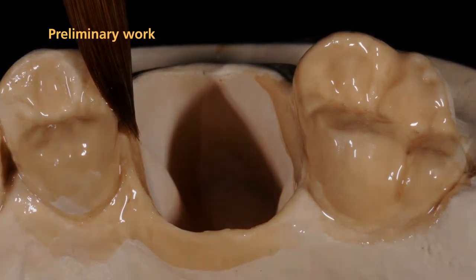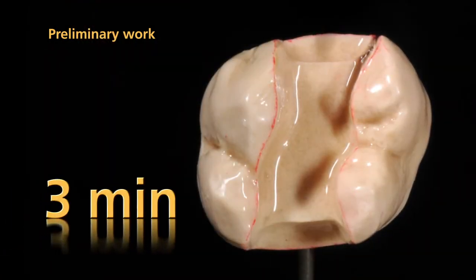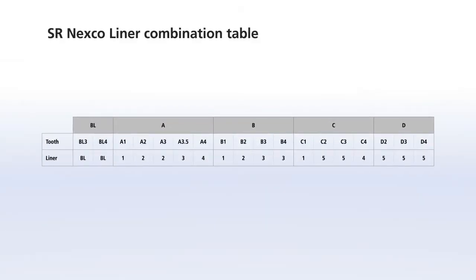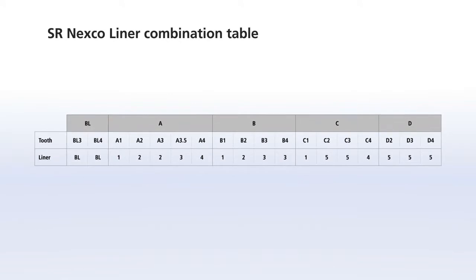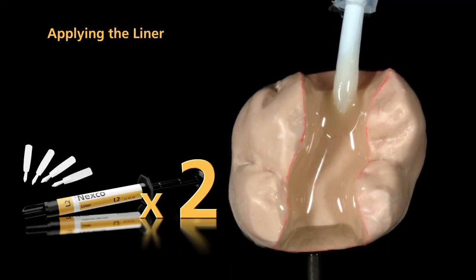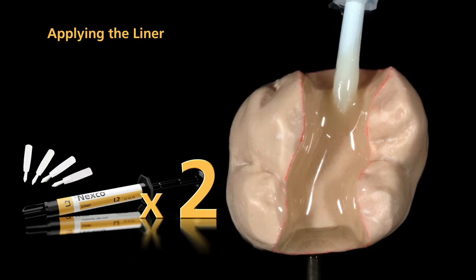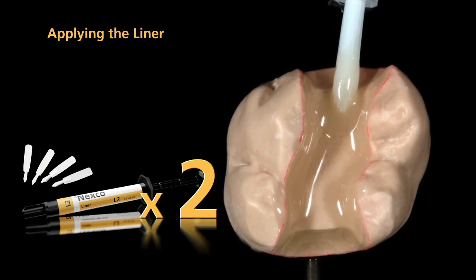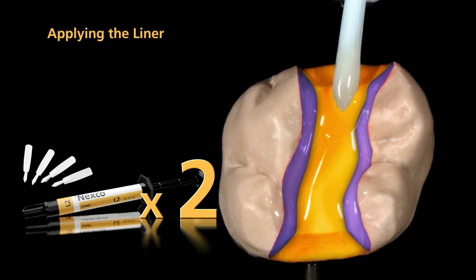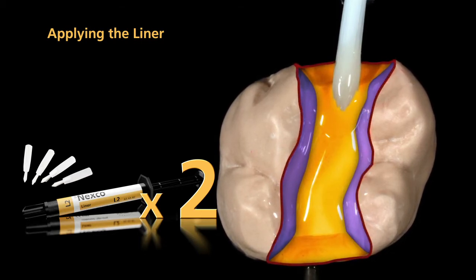Allow the individual coatings to react for three minutes each. To achieve the desired tooth shade, please observe the liner combination table. The liner is applied in two coatings. Apply the first layer of liner in a thin coating to the cavity walls and to the cavity floor. Do not cover the marginal areas at this step.